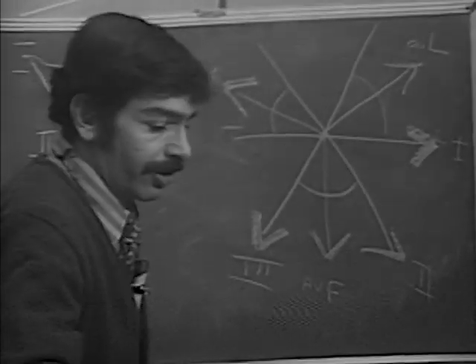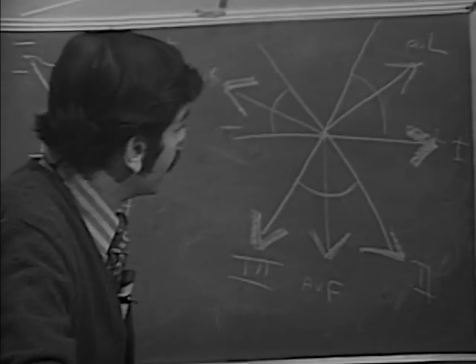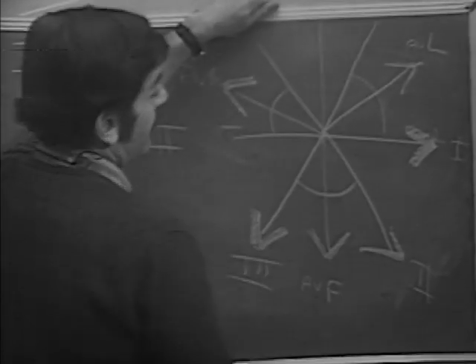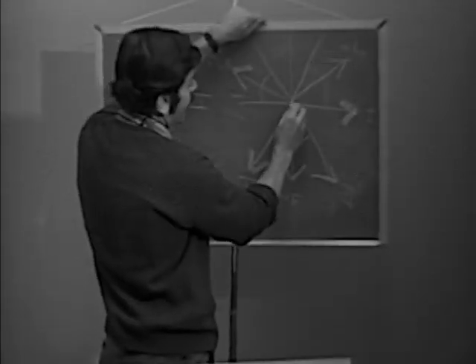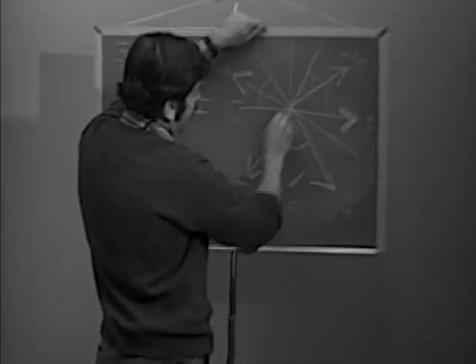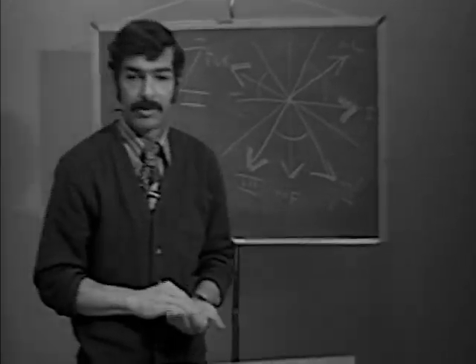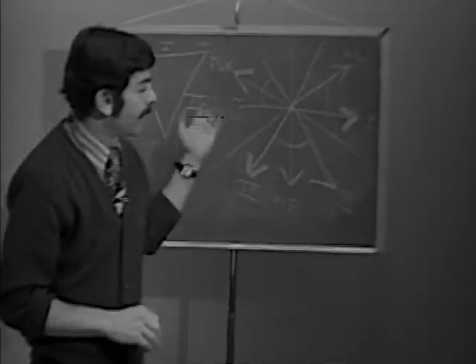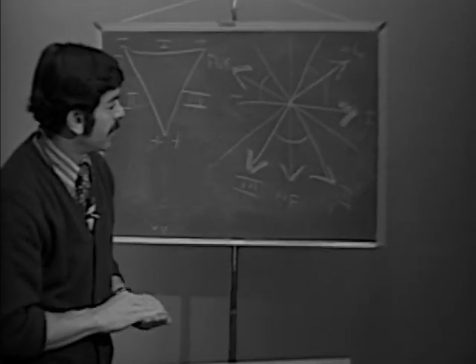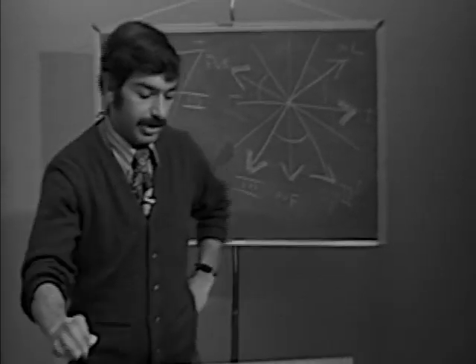Okay, so those are the 6 frontal plane leads then, which we will use for deriving axis. Now, if we just take AVF and continue that on the negative side, and the same thing with AVR, extend that through, and take AVL and extend that all the way through too in a straight line, we have the composite diagram, which covers just about every possible direction. And most of you have seen this diagram in one form or another, if you've looked at any EKG book.